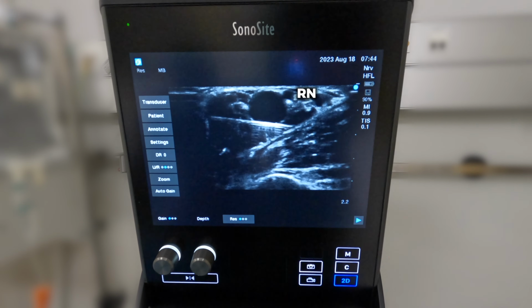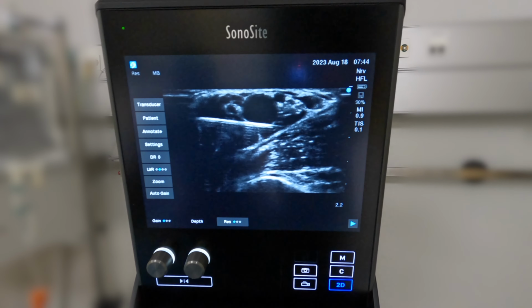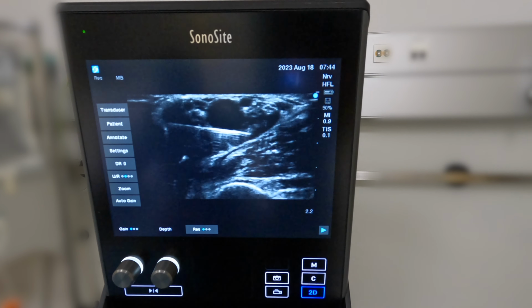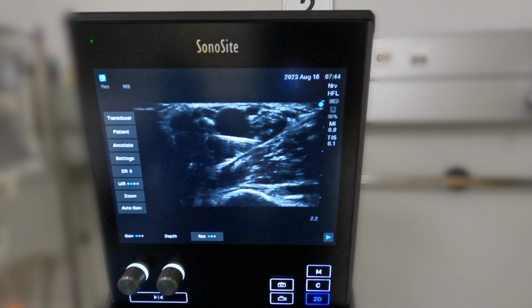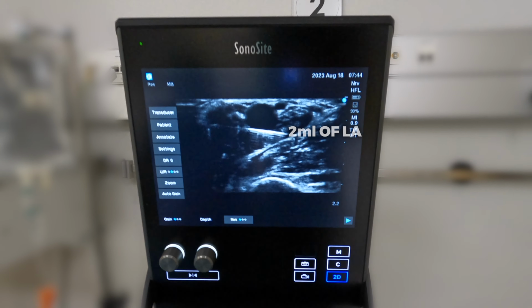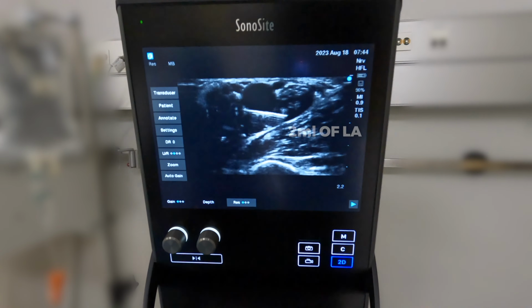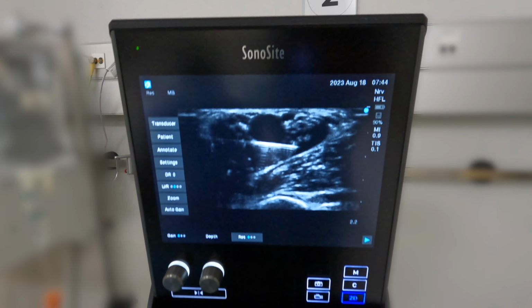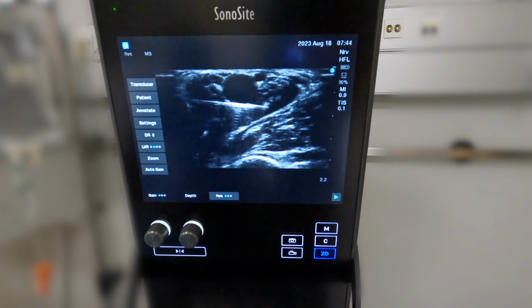You see how the radial nerve is being lifted now? Okay, keep going. How many cc's have you given so far? 2 now. Okay, very good. Keep going. Three. Keep going. So now you can see the ulnar nerve. You can see how this injection also blocks the ulnar nerve as well. So 4 total.